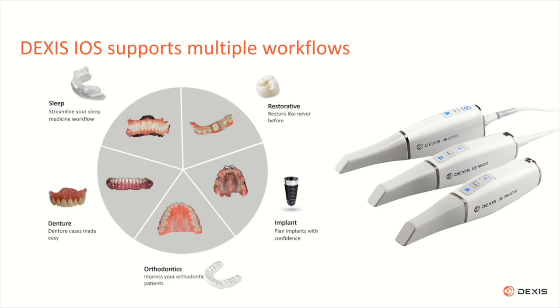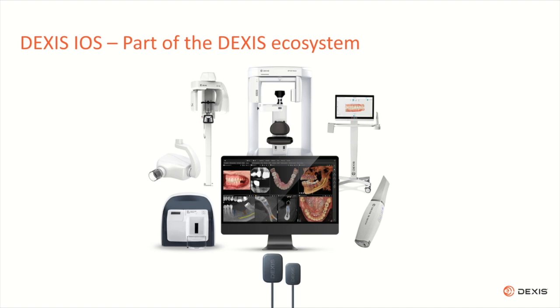And now you can see in what cases you can use DEXIS intraoral scanners. Our solutions have been used among orthodontists, which I will show you today, but also in case of implant planning, dentures, restorative cases, and for sleep medicine. But DEXIS is not only intraoral scanning. We also have in our portfolio radiological devices such as solutions for 2D intraoral X-rays, as well as panoramic, cephalometric, and CBCT devices. And all this connects to our main software, which is DX Studio Clinic, which you can see in the center of this picture.